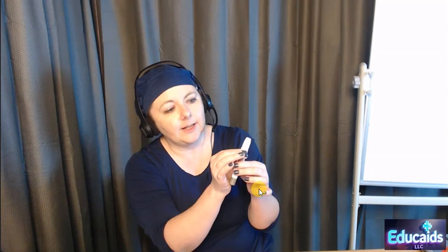Then we're gonna put this on. So after I've put my needle in here, and it tells you, there's a little arrow. They're pretty straightforward on how to do. So I put that together.